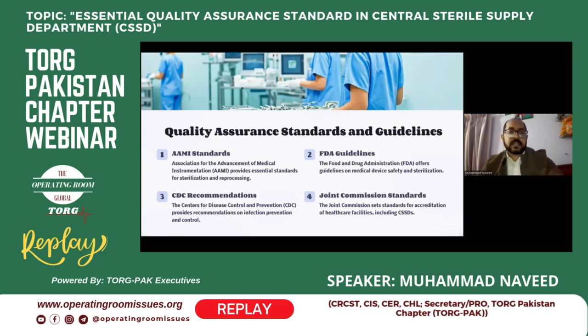And the CDC recommendation. Here is the third one. The Centers for Disease Control and Prevention provides recommendations in infection prevention and control. CDC has the most famous guidelines, giving us information about sterilization and disinfection. They also give us recommendations on which guidelines we have to follow to achieve the patient safety level.